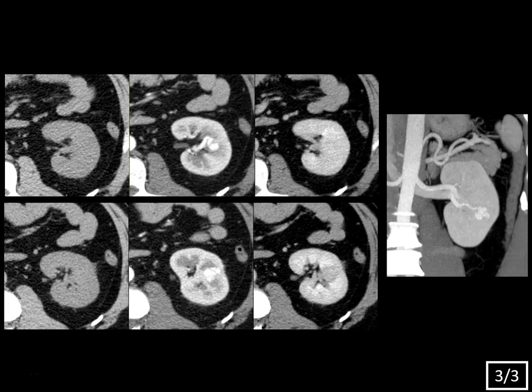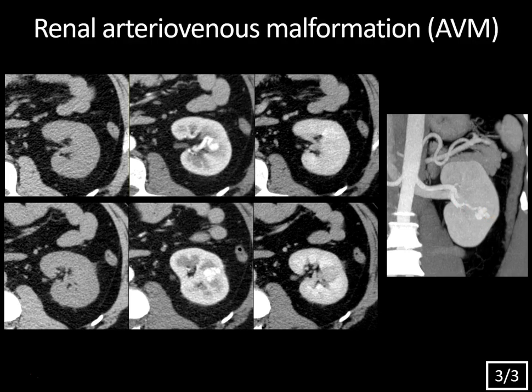On multi-phase CT of the kidney using a renal mass protocol — showing non-contrast, corticomedullary phase, and delayed nephrographic phase — we have a tortuous feeding artery leading to a vascular nidus in the interpolar kidney on the corticomedullary phase. On the 3D MIP reformatted image, you can see the tortuous feeding artery to this lobulated vascular nidus with a draining vein. This is a typical renal AVM — an arteriovenous malformation — an abnormal congenital communication between arteries and veins with a vascular nidus.